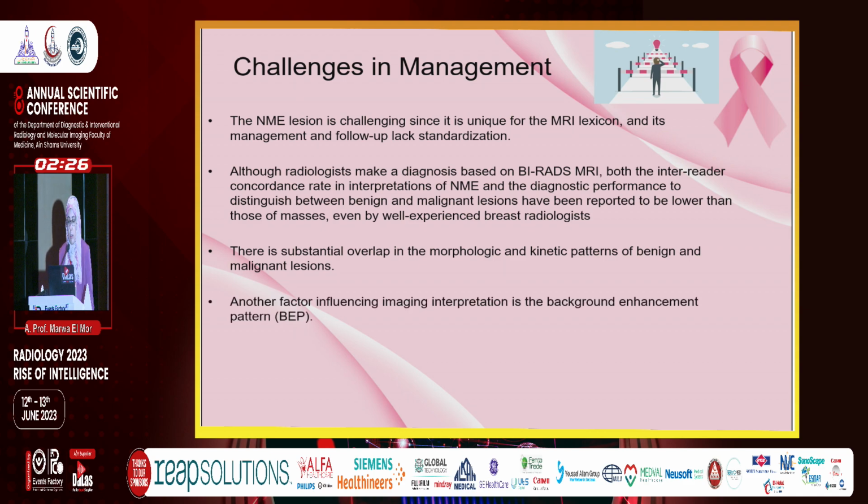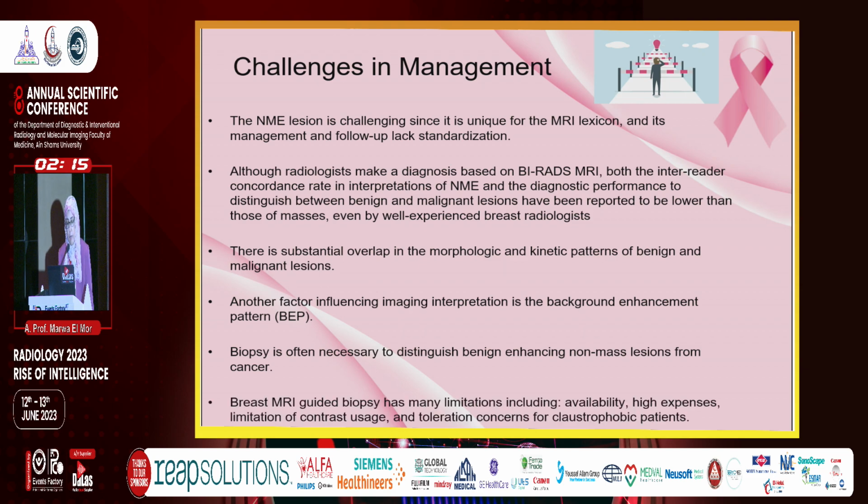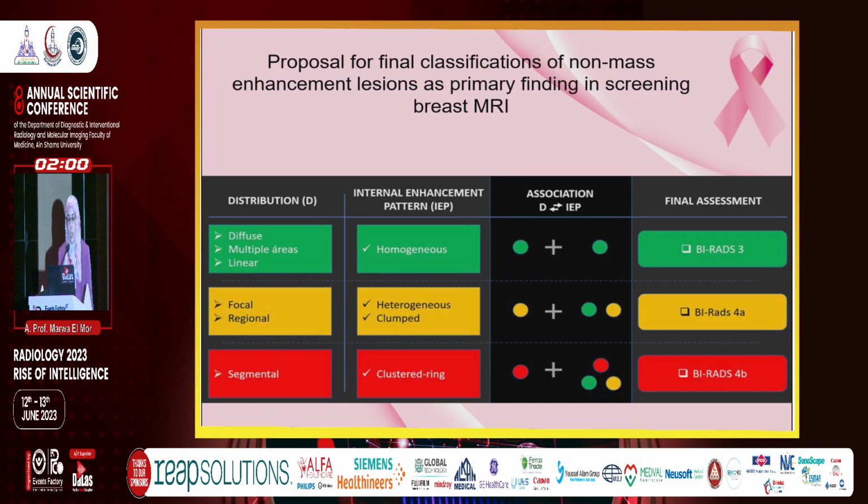Another factor influencing image interpretation is the background enhancement. Biopsy is often necessary to distinguish benign enhancing lesions from cancer, yet MRI-guided biopsy has many limitations, including availability, high expenses, limitations of contrast usage, and toleration concerns for claustrophobic patients.